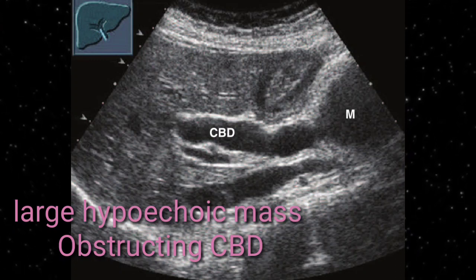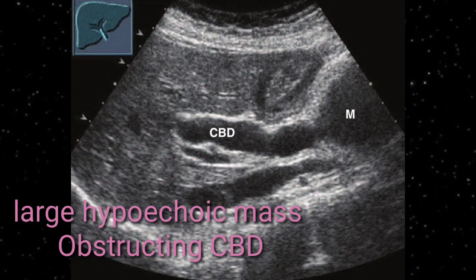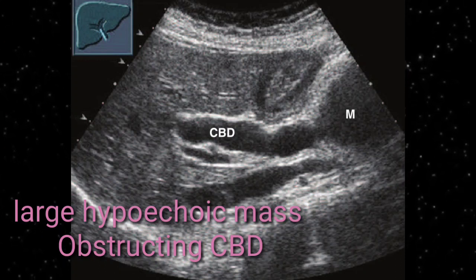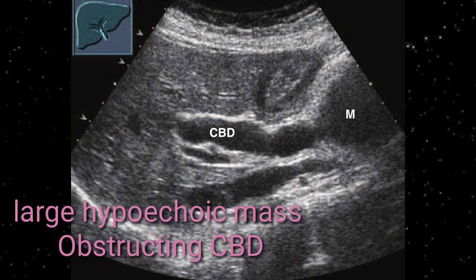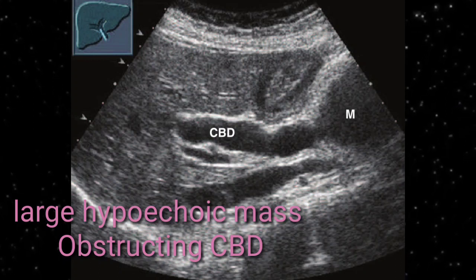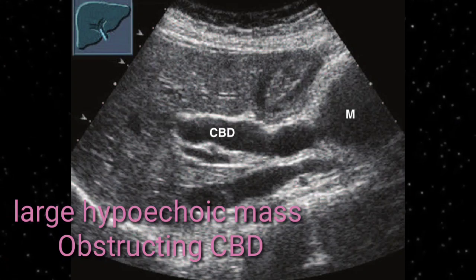One can easily appreciate that if you focus on the CBD, whenever the CBD is dilated, always look at the pancreatic region, and always look at the neck of the gallbladder region for any enlarged masses or enlarged lymph nodes. But this is the classical example of pancreatic ductal adenocarcinoma involving the head region and causing CBD dilatation.